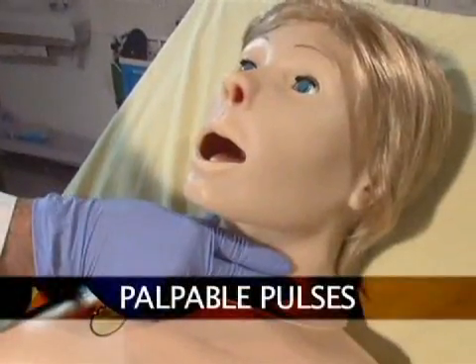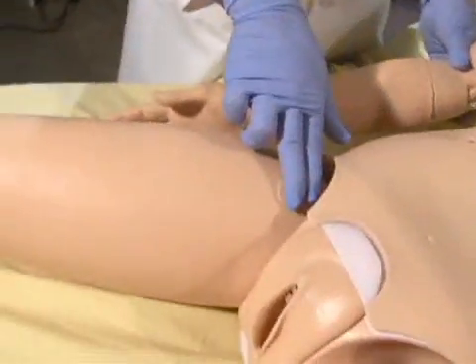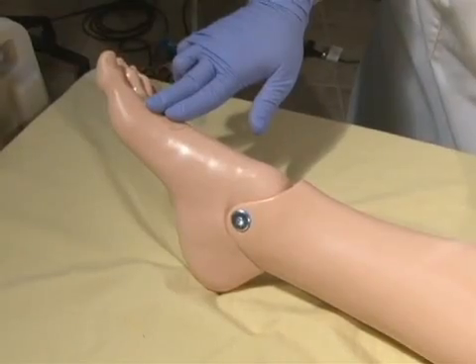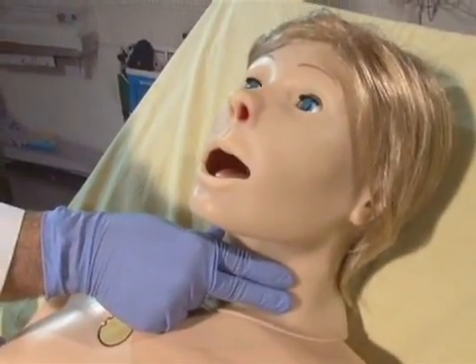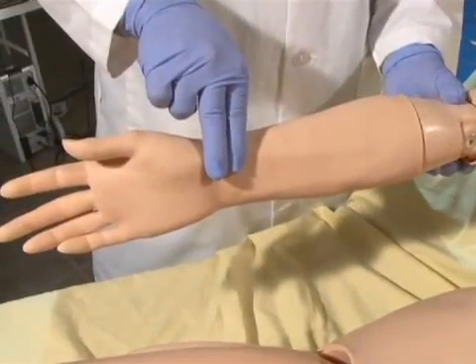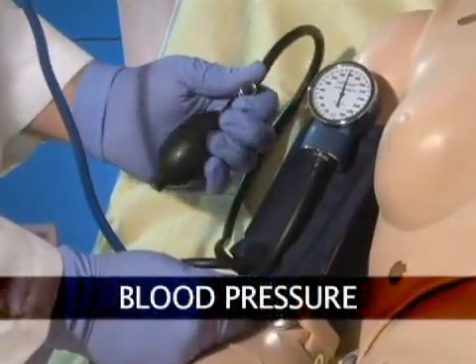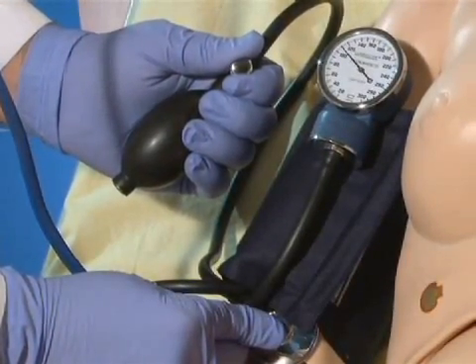Bilateral carotid, radial, brachial, femoral, posterior tibial, and pedal pulses operate continuously, synchronized with the ECG. Pulse strength varies with Suzy's blood pressure, and distal pulses can be disabled to simulate severe hypotension. Programmable blood pressure can be read using a sphygmomanometer, and users can auscultate the Korotkoff sounds.